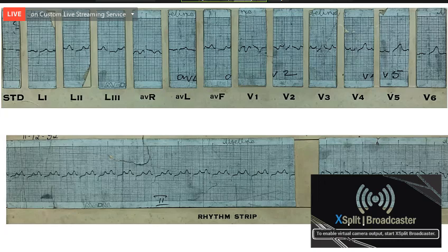See, is this patient having... Do you want to modify the RVH? I would like to say RVH with strain, with ST-T changes. Yes, sir, RVH with strain. So what does that mean? Suprasystemic. When there's RVH, especially with a QR pattern and ST-T changes suggesting a strain pattern, then you have to consider that the patient may be having suprasystemic pulmonary artery pressure.